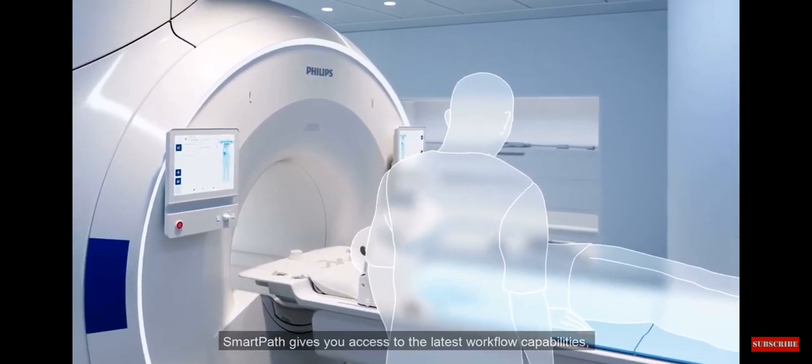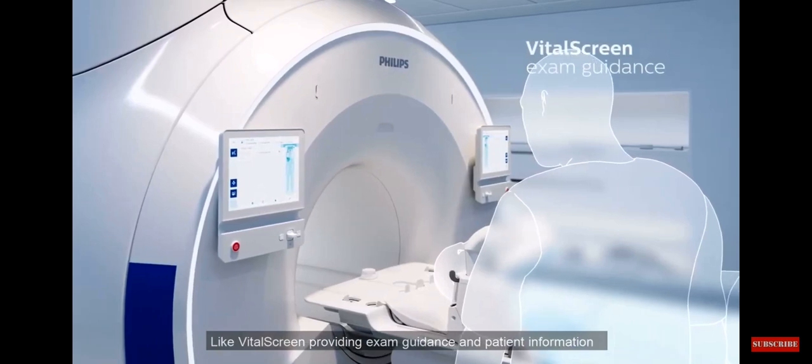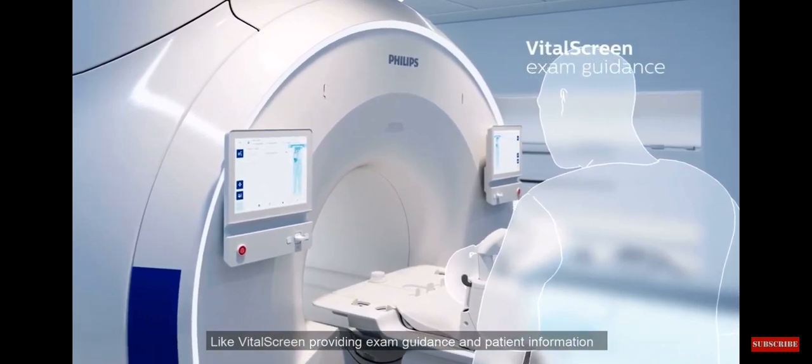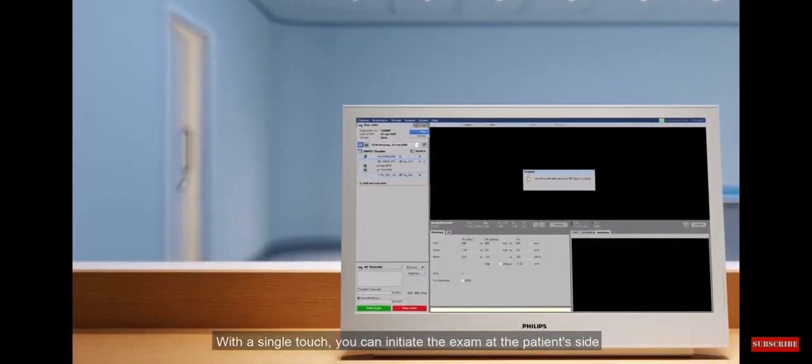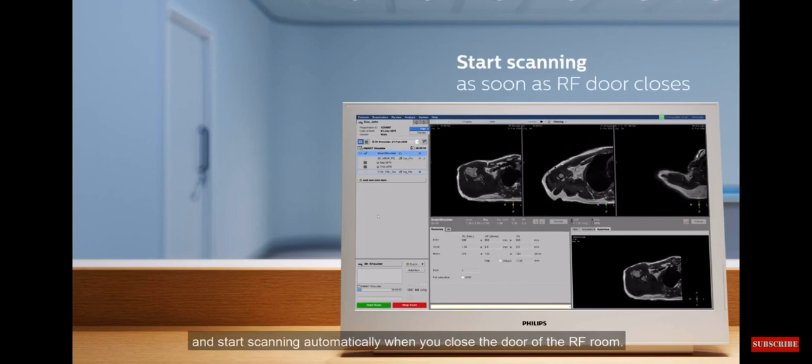SmartPath gives you access to the latest workflow capabilities like VitalScreen, providing exam guidance and patient information. With a single touch, you can initiate the exam at the patient's side and start scanning automatically when you close the door of the RF room.